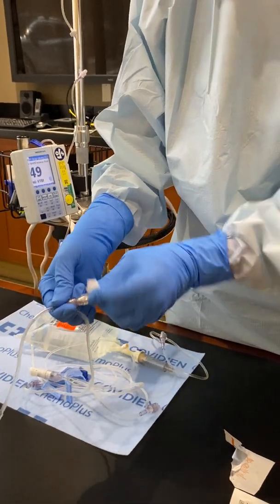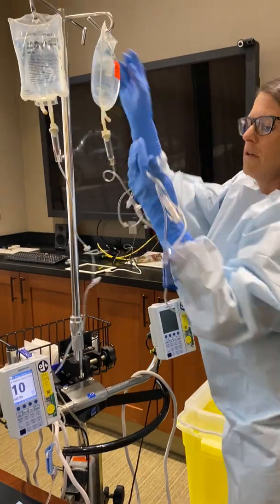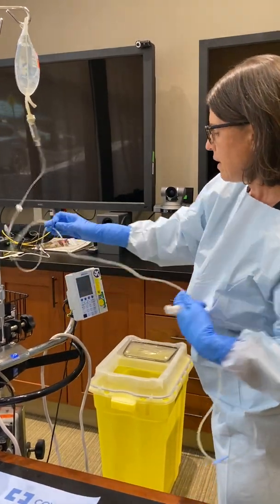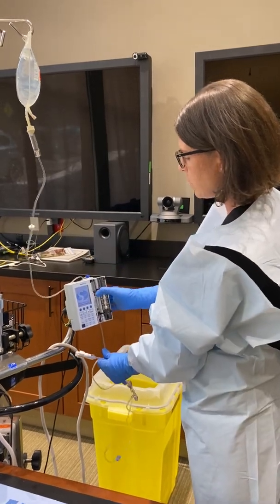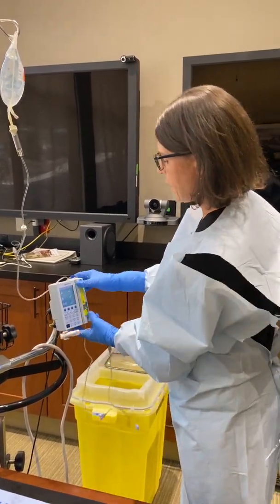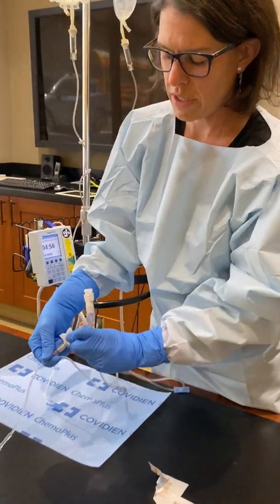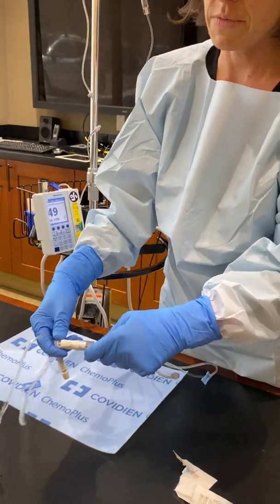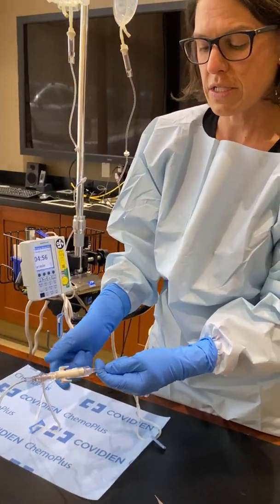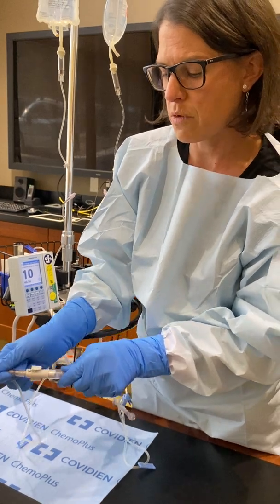Once you put that on there you can clean that hub again. I'm going to hang my chemotherapy first. Go ahead and put this into the pump, taking care not to touch too much of the pump. You will need to close the door, but that is where I stop — I don't touch the buttons with my blue gloves. Clean the port you're going to hook up to, then this piece comes off and this snaps on. This connector is part of USP 800 — it's a closed system device, so when you detach this, in theory there is absolutely no chemotherapy on that hub, protecting you from any kind of exposure. Those snap together.